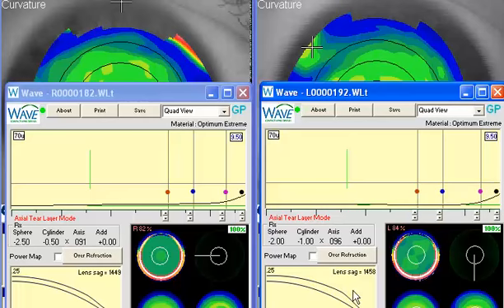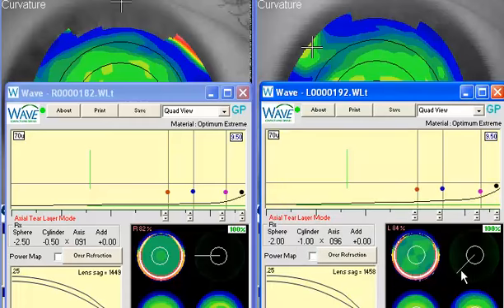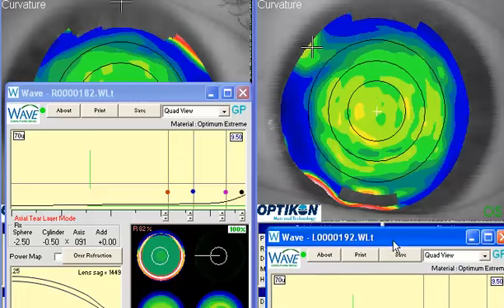And then, again, we'd incorporate the over-refractive data. Again, if you have good over-refraction data from their old lenses that they had to go back to, you can include that right here, and this will get this lens a little closer to where you're heading. Just hit cancel. And now, if you have over-refractive data, you've got a lens where you're not getting weird induced cylinders. Now I think if you have to add in any over-refractive cylinder, you'll have a much better likelihood of being successful with that. So hopefully that'll get you where you need to be.